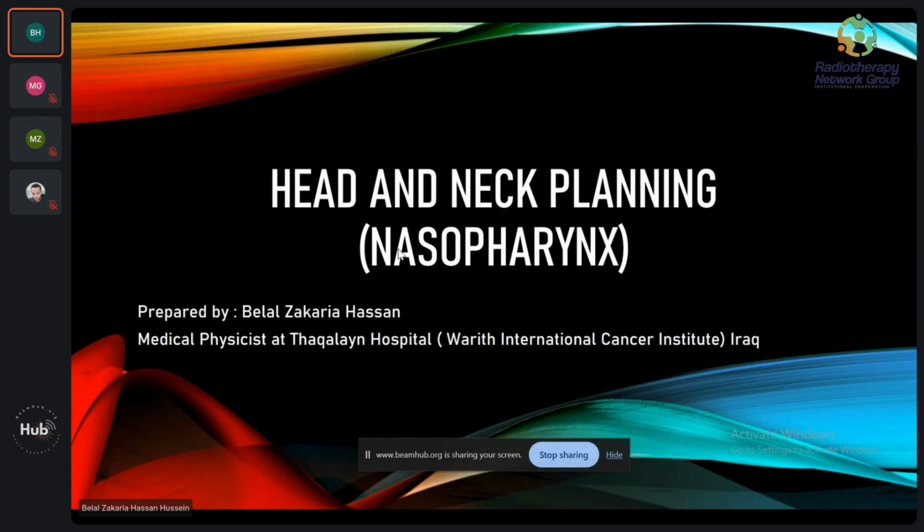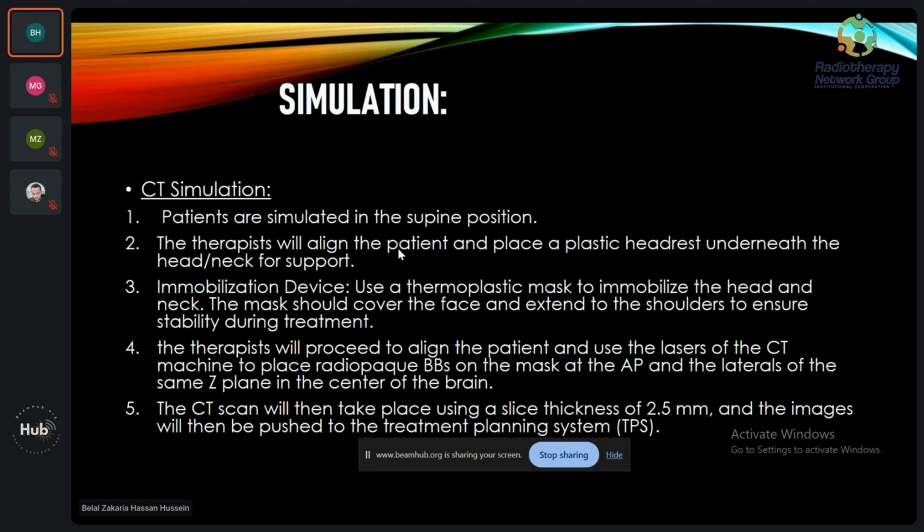Thank you, Dr. Ramay and Dr. Muhammad, for your question. I will start from where Dr. Ramay went. I will go back again to the part for simulation. This is the important part for our patient to start with the radiotherapy, to take the radiotherapy treatment.